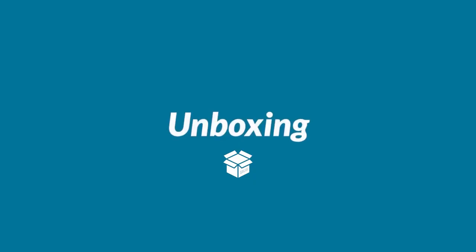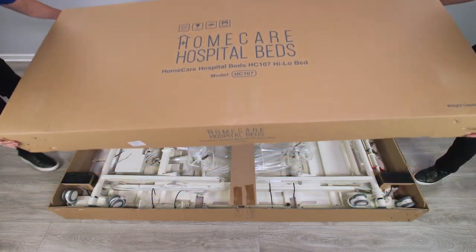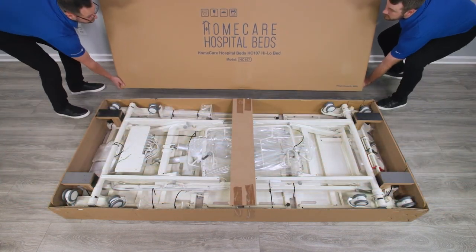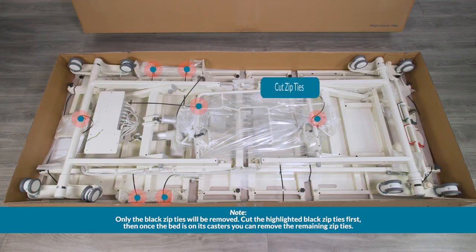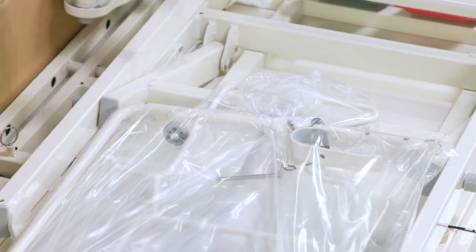Unboxing. Lay the box flat on the floor near a wall outlet and remove the top half of the box. Locate and cut the zip ties that keep the bed closed during shipping. We recommend removing the zip ties in two phases. Take care not to damage the bed frame or any wiring when doing this.